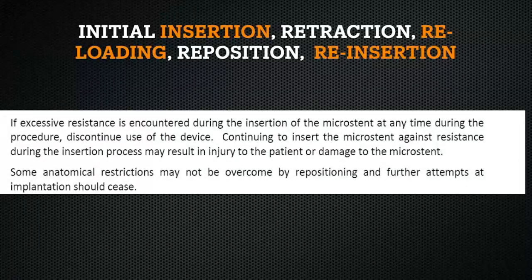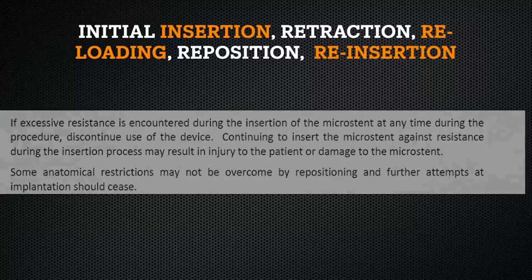We went over several insertion techniques in our last video to help with this. If you've done all these and still have difficulty, here are some examples of initial insertion, retraction and reloading, reposition, and then successful reinsertion.